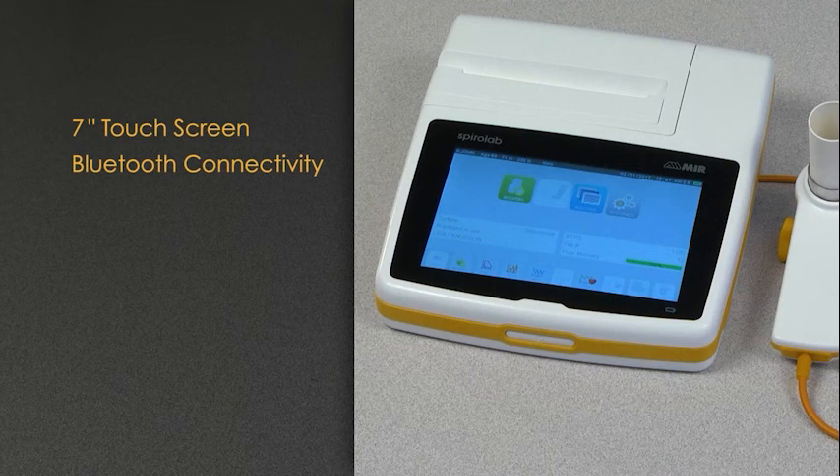upload the test results into the WinSpyroPro software, which is included with the device.